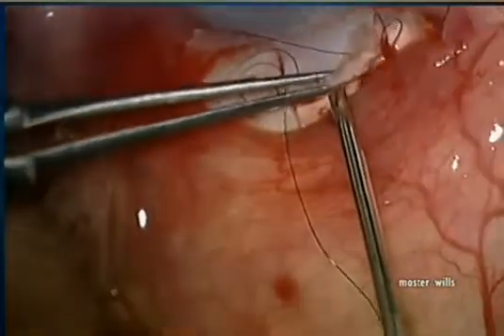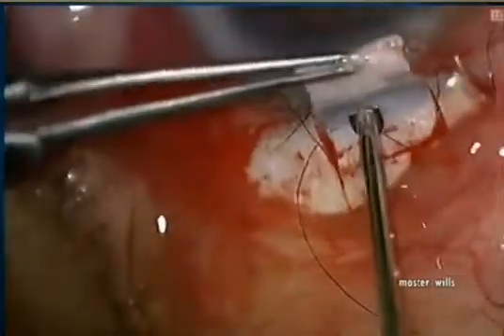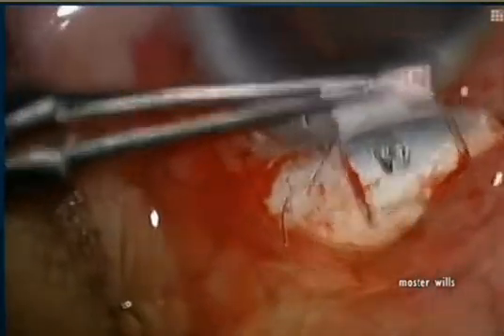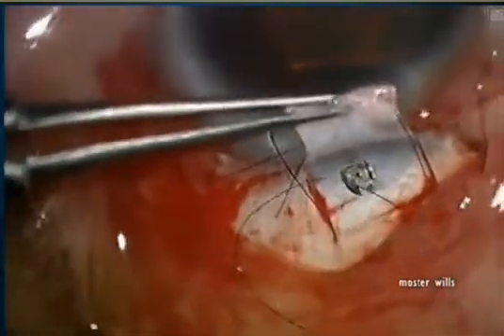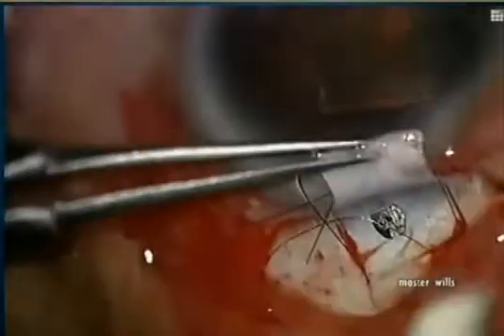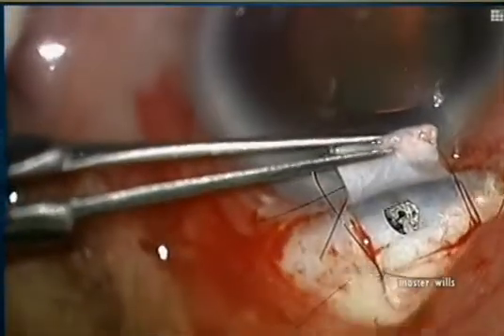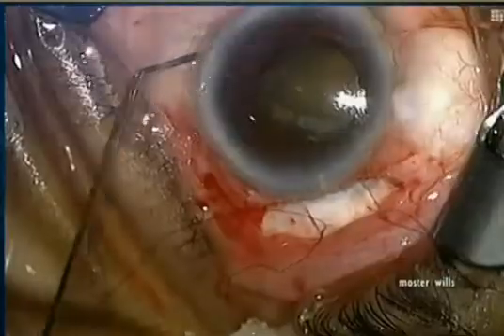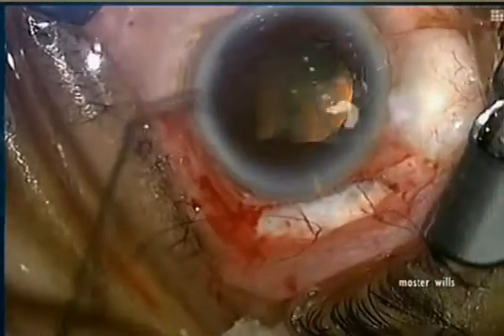The inserter is connected to the express. You feel an audible pop and then rotate it — it's moved first on its side and then centered. Immediately you'll see egress of aqueous through the 50 micron hollow bore, and this is how it looks — you see the fluid flow.